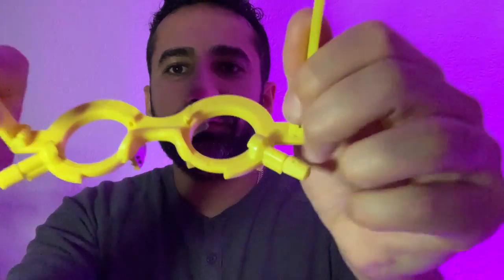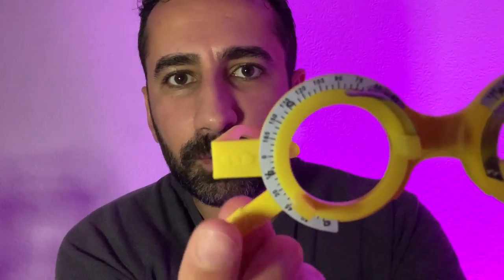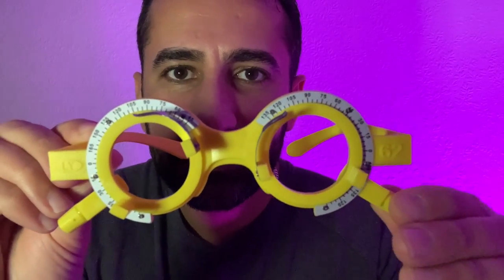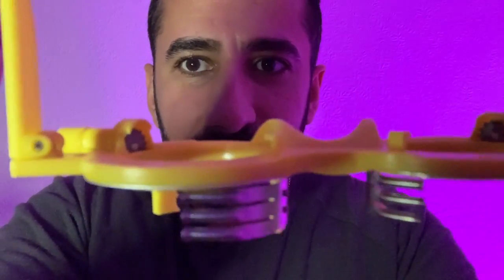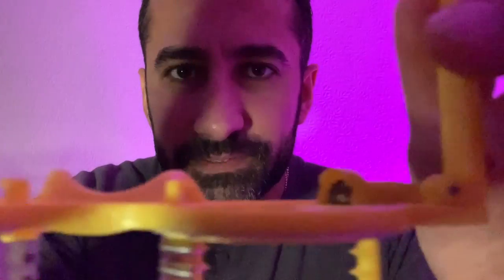Place them on yourself like so, and we have the little dials here for turning the lens holder for checking your astigmatic axis. We also have some slots at the back of the trial frame, which is where I like to place the spherical lenses for your distance. So that's the lovely set of five colourful trial frames.